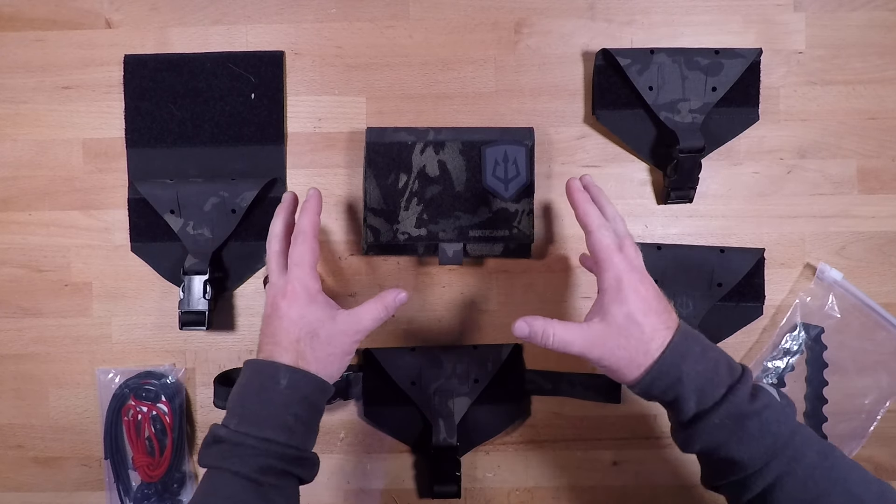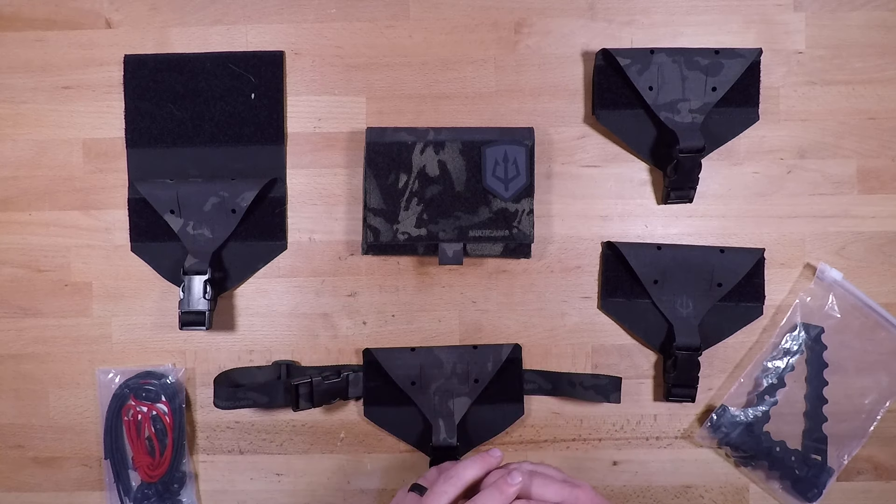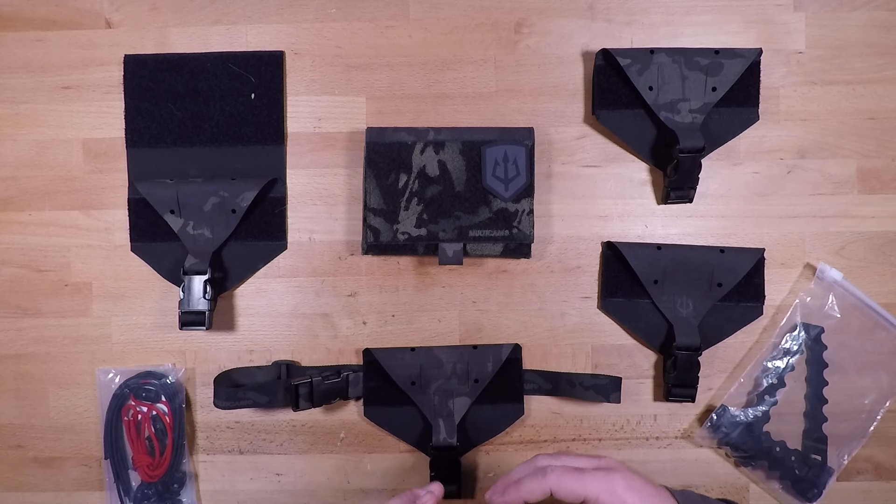The primary focus of this video is going to be the medical aspect of all of it. We'll go through all the individual pieces and then at the end we'll talk about some of the adaptive and multifunctional things you can do with this system, going beyond just that medical use.